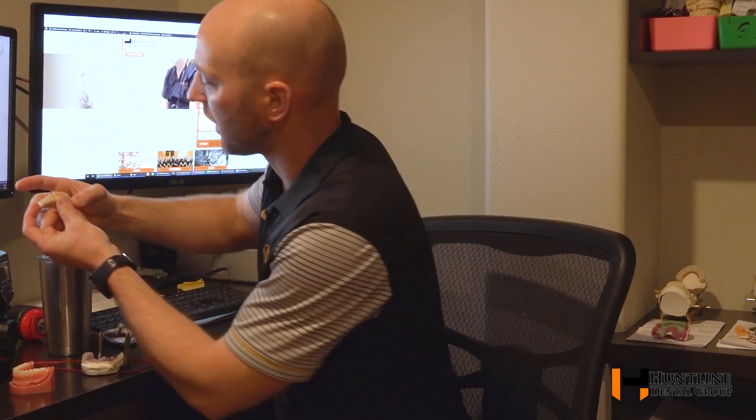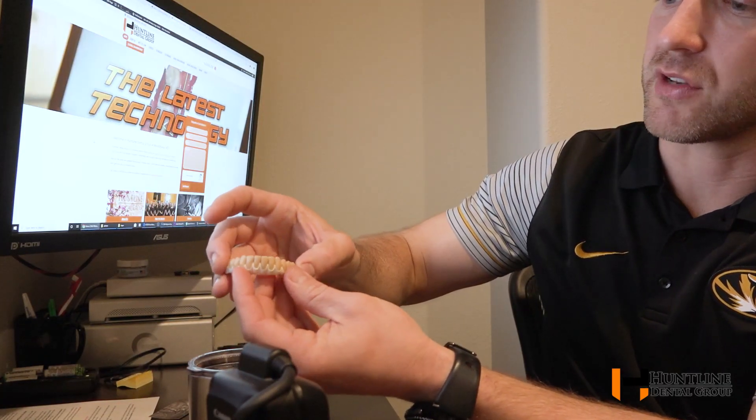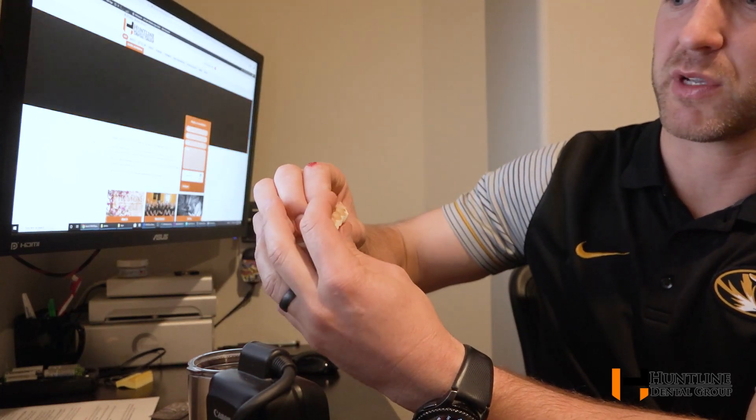The Trilor is strong enough that we can still keep the prosthetic as low profile as possible. These are obviously not done — these are setups we're doing in wax for try-ins for patients in their mouth. But this is something we're very excited about here. This is a new version of the roundhouse prosthetic and I wanted everybody to see it.